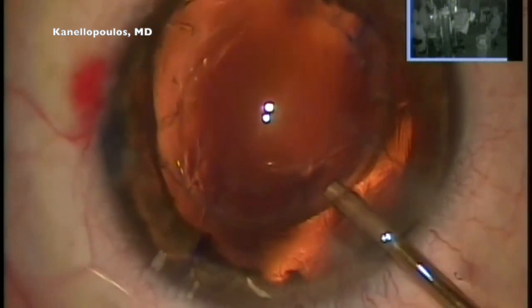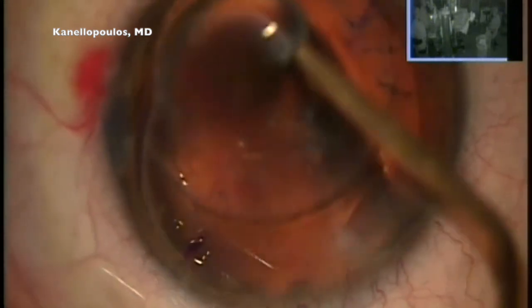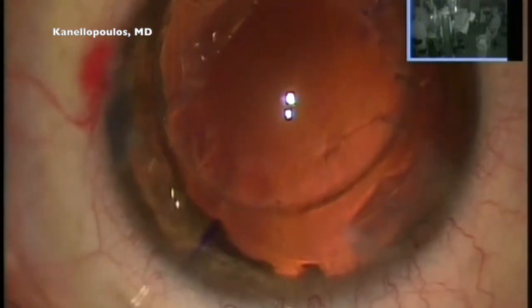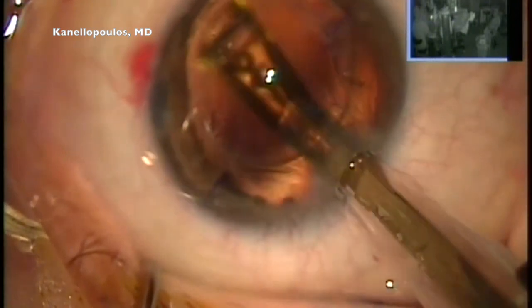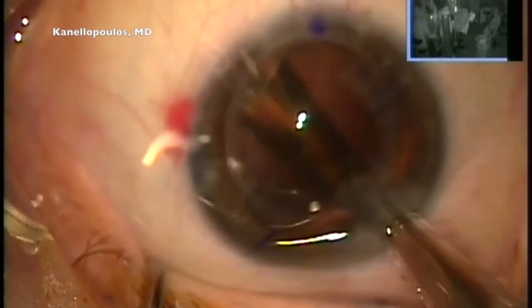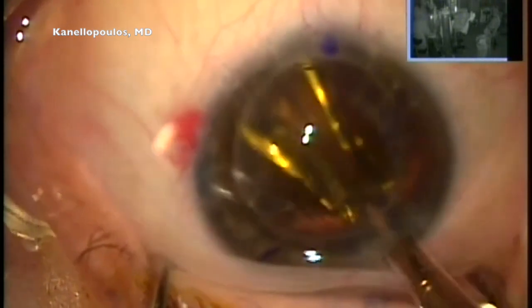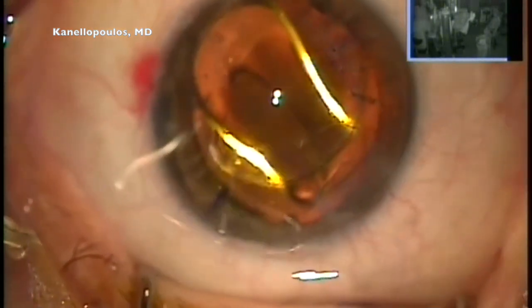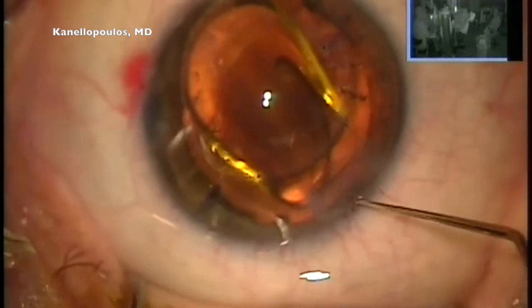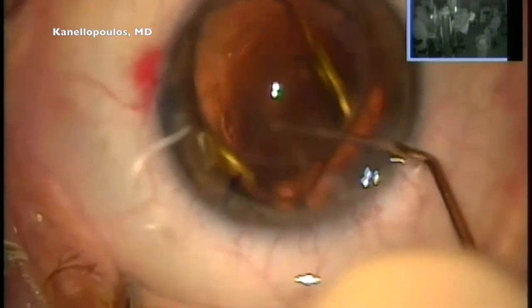Now we're here to inflate the capsular bag and go in with our favorite toric IOL — the aspheric Acrysof toric. We want to correct the astigmatism at the central corneal diameter that we measured. I'm going to place the lens, and of course the issue now becomes how to treat the extreme photophobia this patient has from the significant iris dialysis from the injury, which was done at a state hospital in Athens.